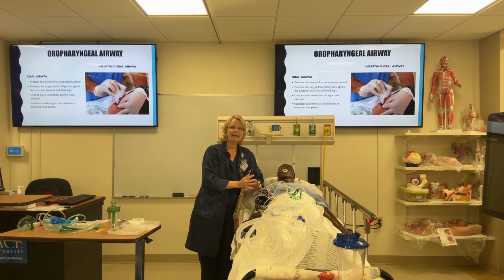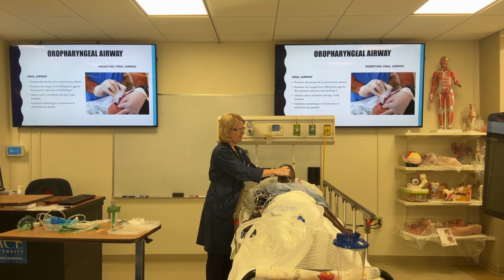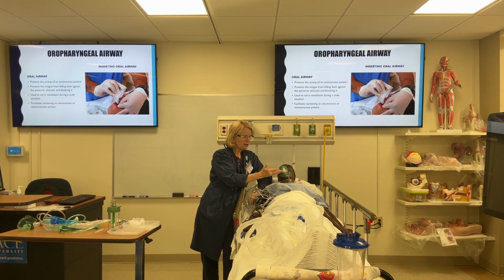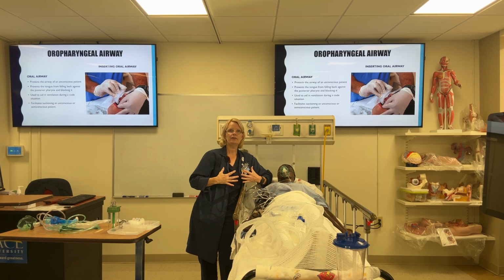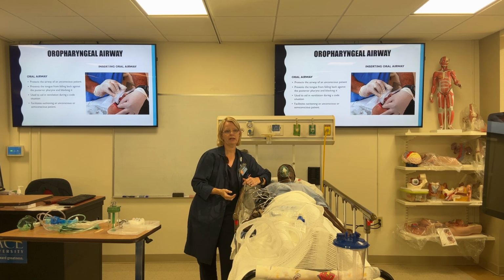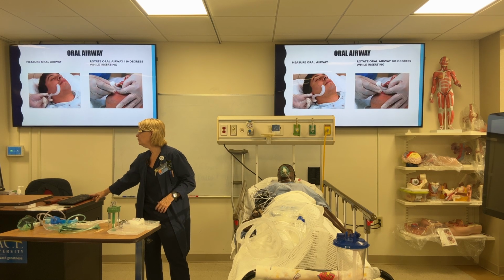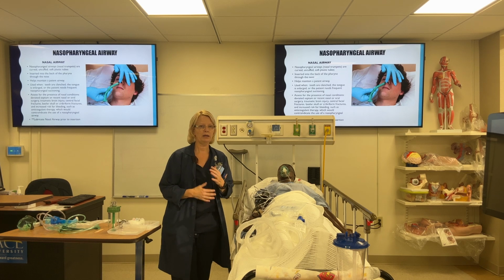Again, once that's in, you want to go ahead and put your simple face mask over the patient, because you need to give them that oxygen via face mask, and you're looking for the same thing. You're looking for chest rise and fall. You're looking for mist in the mask, and you're looking for that O2 sat to come up on your O2 sat monitor, and that patient is no longer struggling to breathe, to get air movement, and the O2 sat slowly comes up, all right? And that's putting in a nasal pharyngeal airway. So I'm just going to show you those slides, which you can scroll through along with me as well.